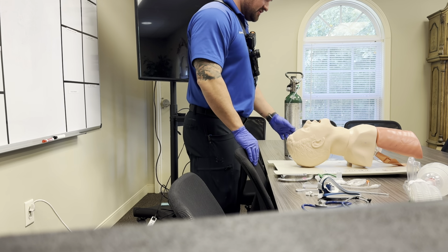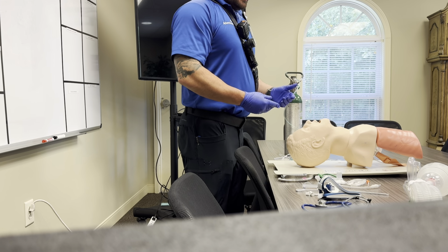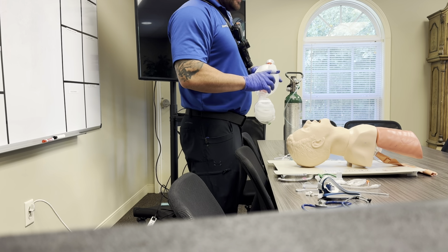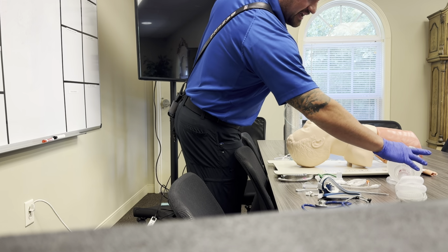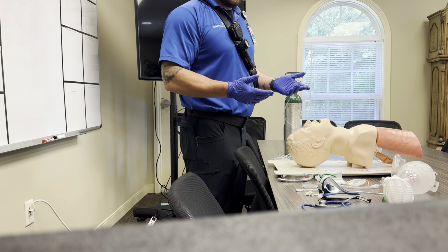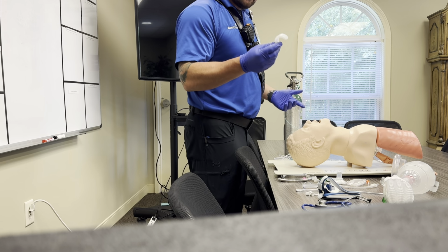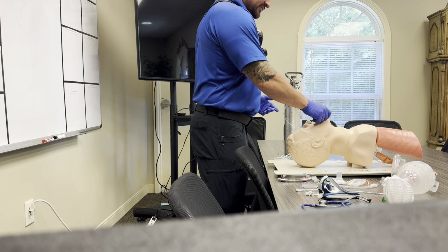We've already prepared our equipment. If this was a true respiratory arrest, your partner would already be ventilating our patient, right? Bagging our patient, as they say. So let's pretend that they're not doing that. And we need to start with pre-oxygenating our patient for intubation, right? So we're gonna select our OPA. Again, not appropriate size for most people, but for this mannequin, it's what we're gonna use.